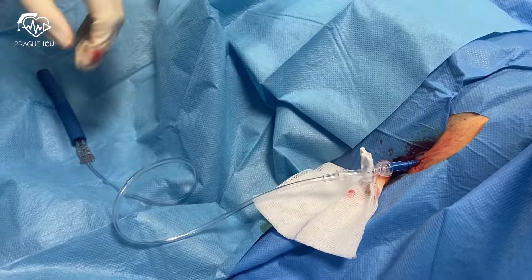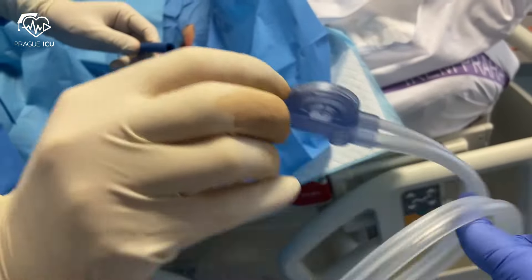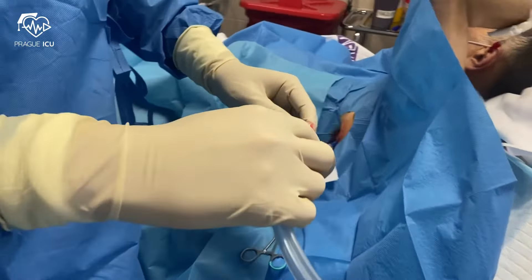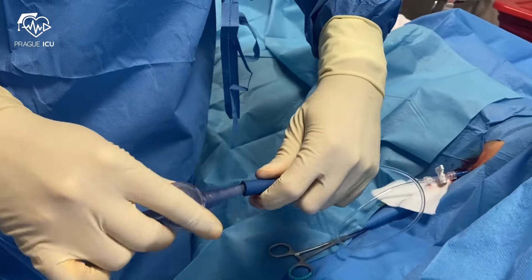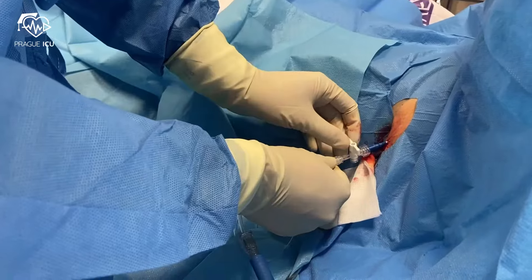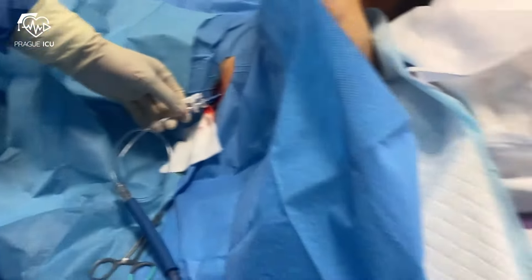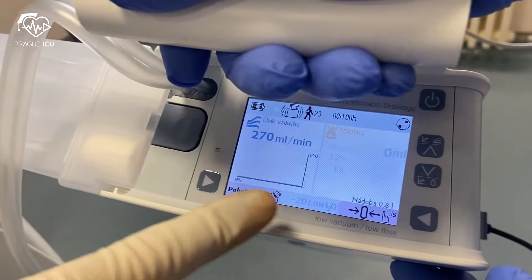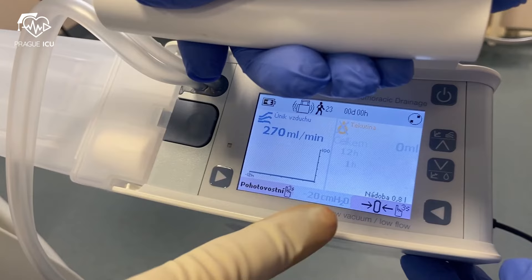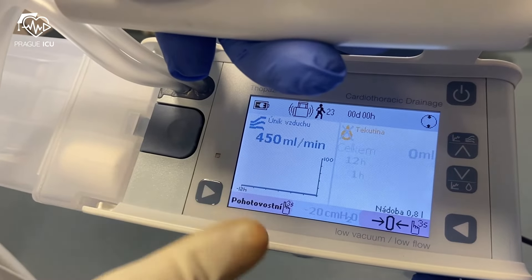In our patient, we use the Medela Thopaz digital chest drainage and monitoring system, which provides precise and objective data about the air leak in a continuous manner. At the bottom of the screen you can see the set pressure that you are currently operating with. On the left side, you can see the current air leak value.